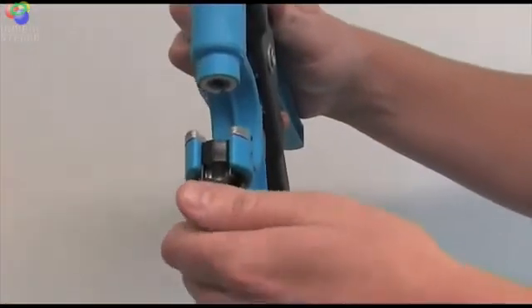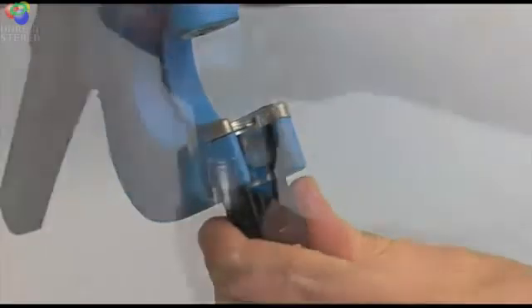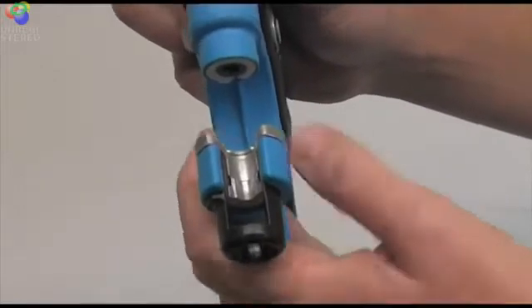To load the gun, first open the tube retainer mechanism by rotating the black base of the gun. Place a punch into the gun so that the clear sample tube sits inside the black tube retainer you just opened.